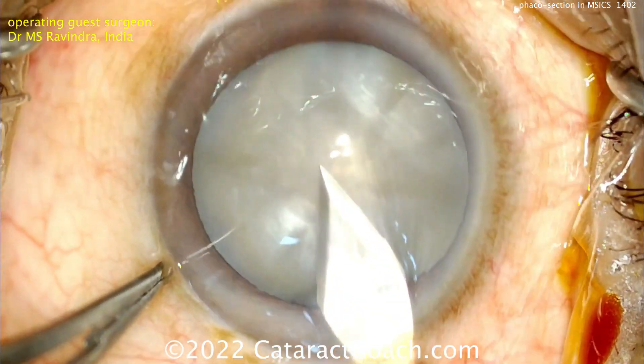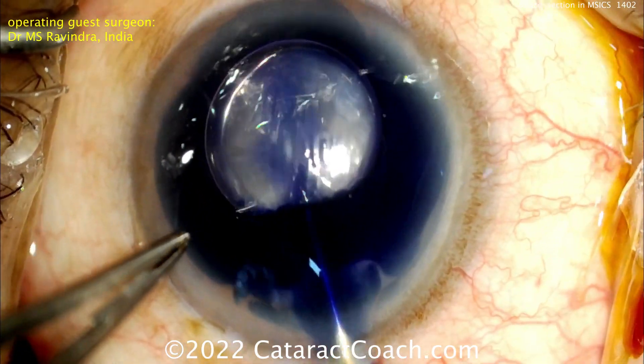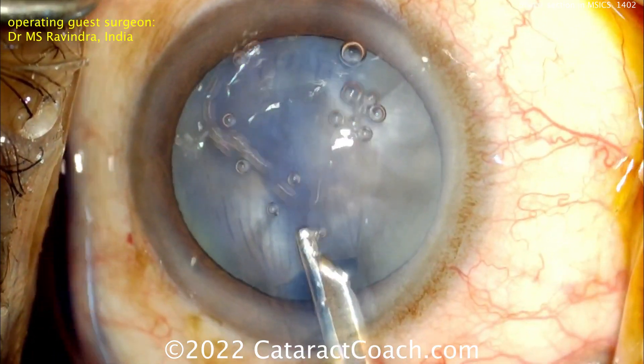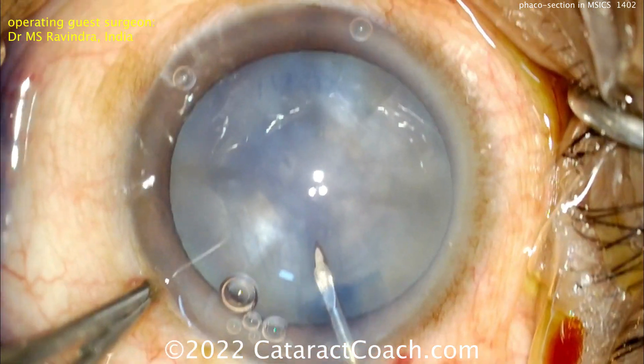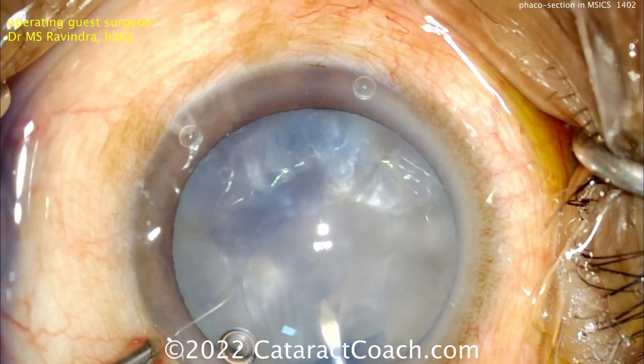The tunnel starts in the conjunctiva. This is not a traditional MSICS incision, but it looks very similar in that it has a nice long tunnel length. A little trypan blue dye going in to stain it — look at the tunnel length of the incision starting at the conjunctival part and going into the cornea. That's a nice long tunnel length that will seal up beautifully.